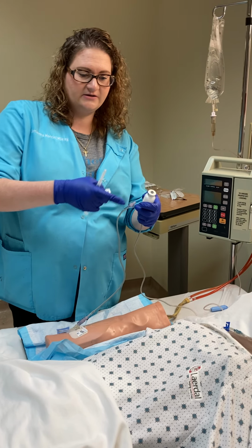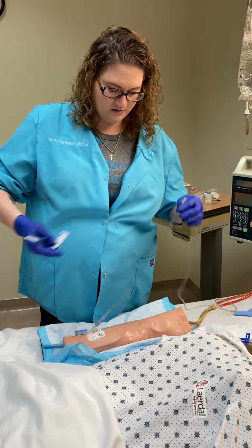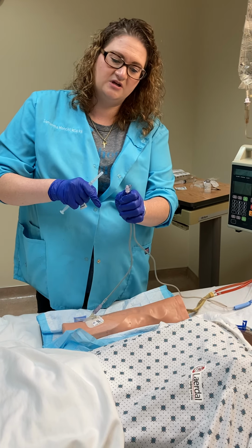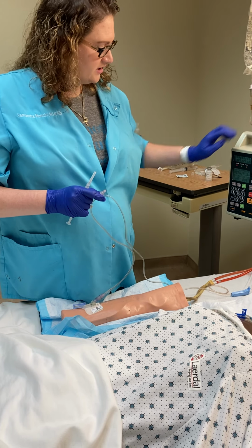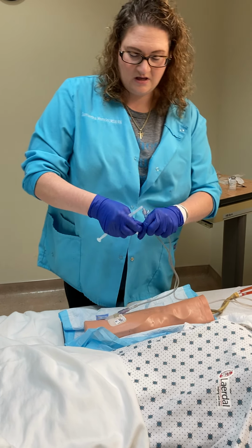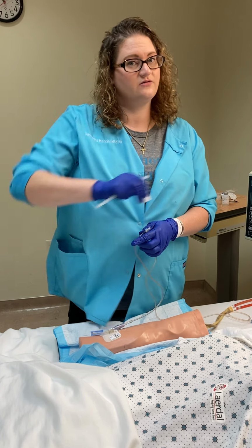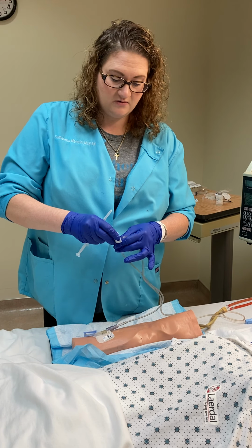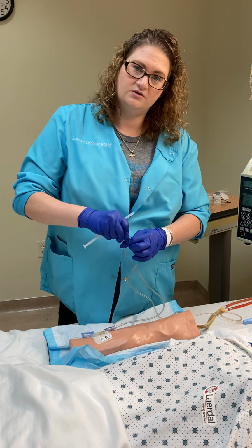We would scan our vial. We've scanned his wristband. Everything matches up there. We're going to take our port that's closest to the patient, and this is where we're going to administer our medication. So we have our pump flowing. And I've looked at compatibility. It is compatible with normal saline. So I know that I can go right through my line, and I'm going to use a kink and release in order to administer it.